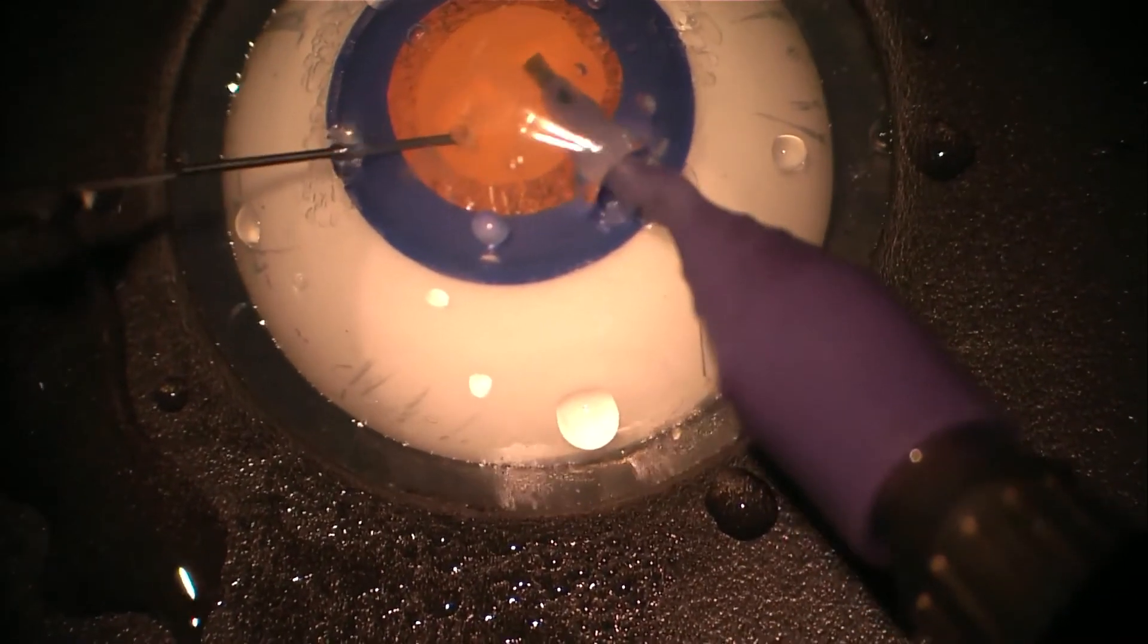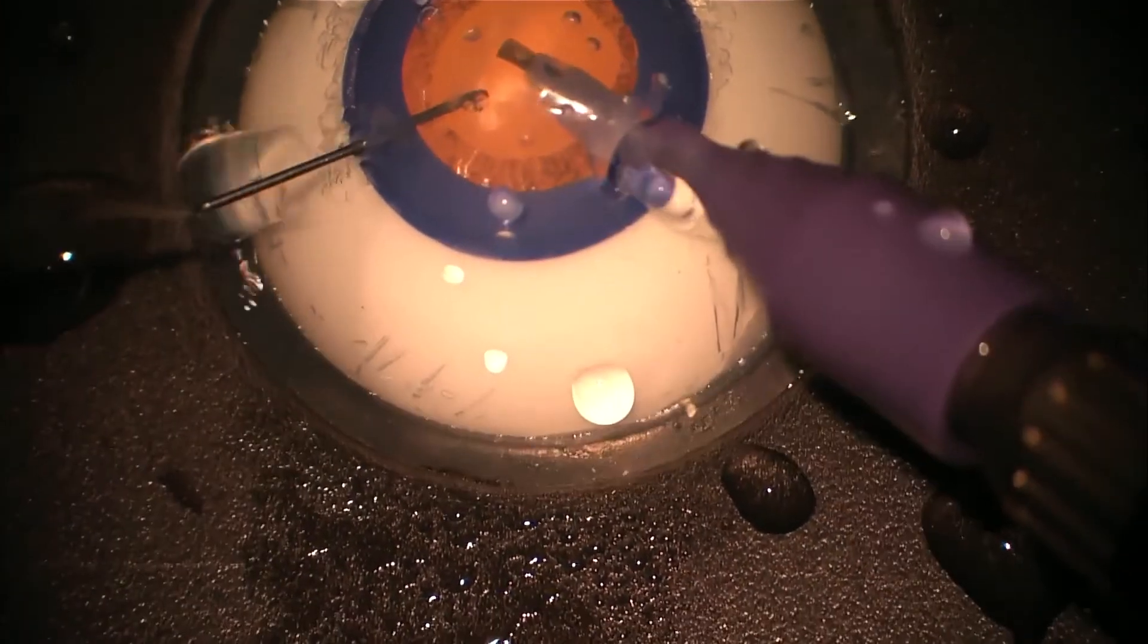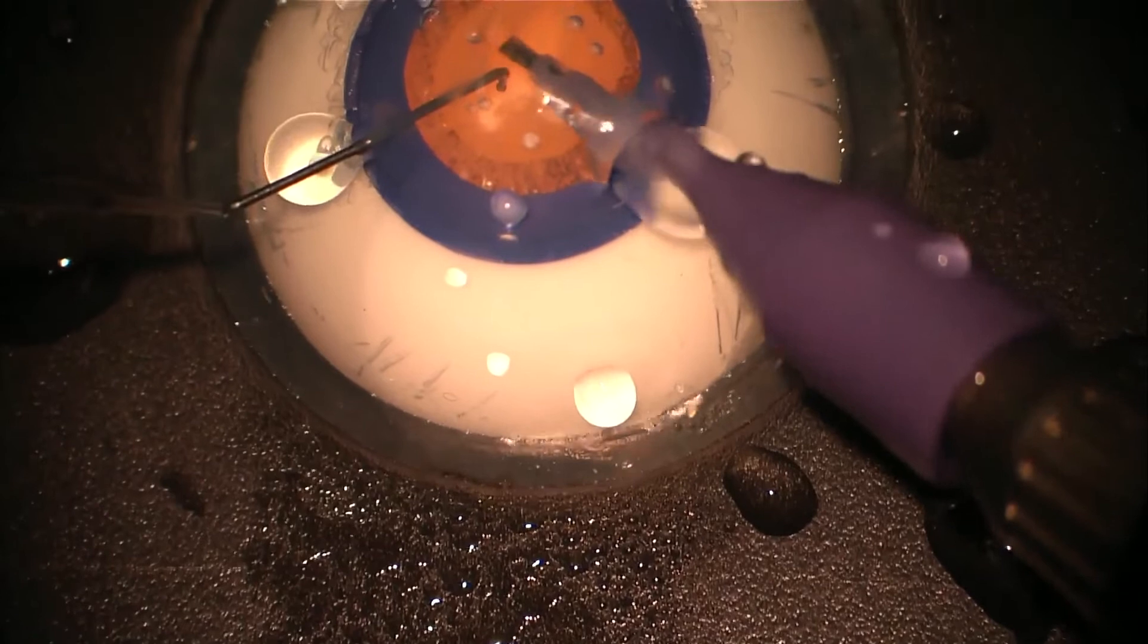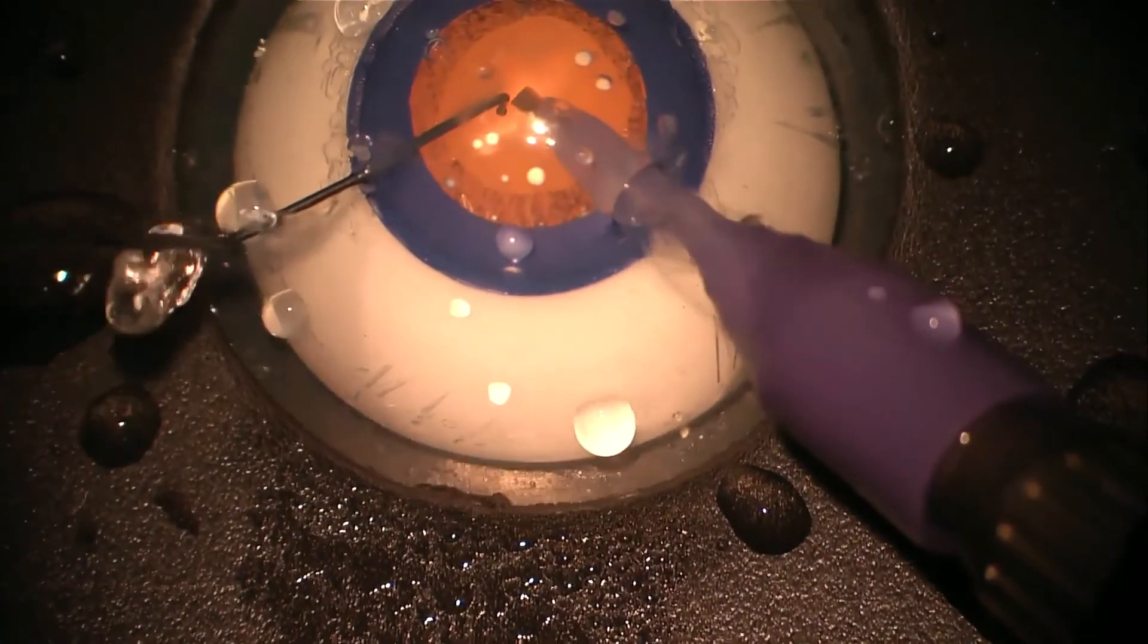Again the same principles of creating a nice divide and conquer type formation before rotating the lens around.